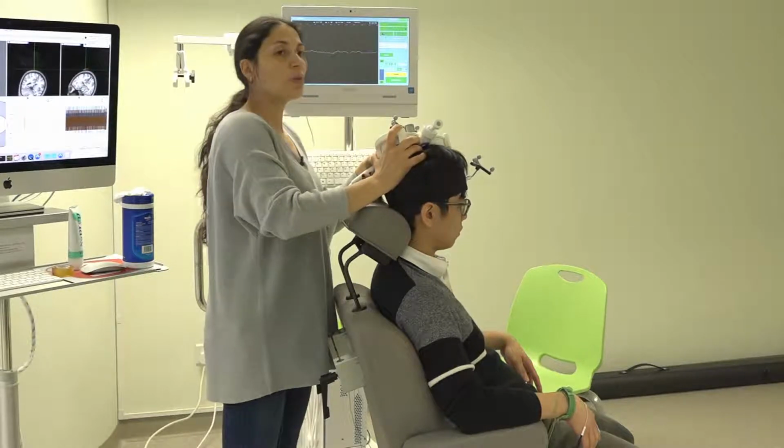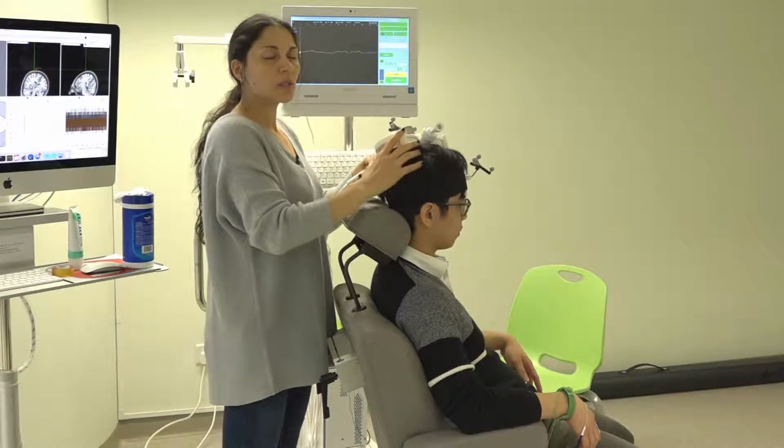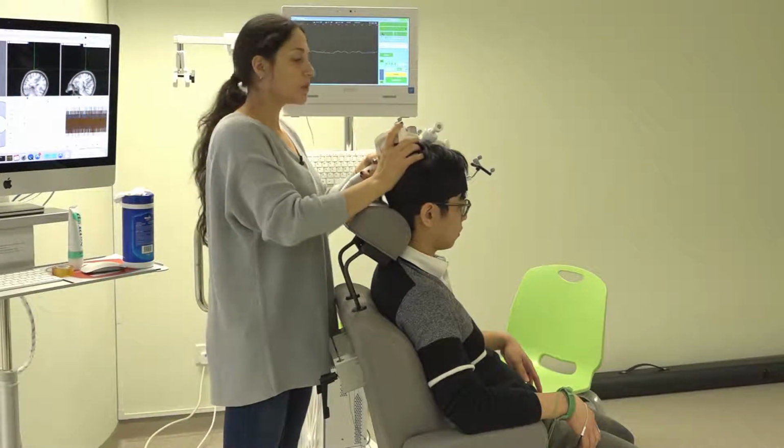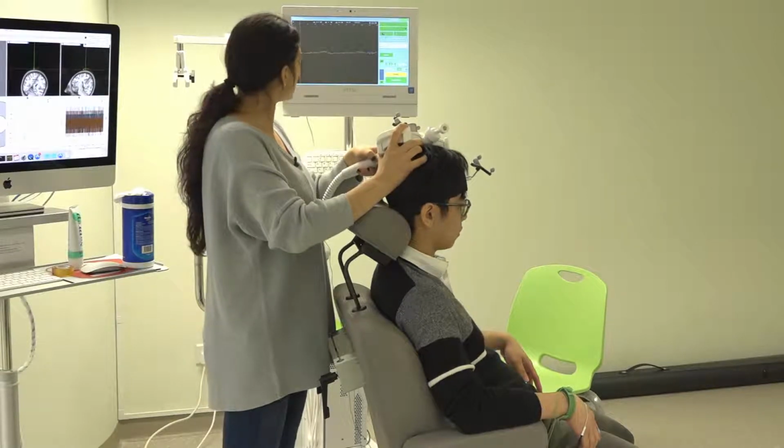He should keep the eyes always open, looking at one point in front. No eyes closed. You don't want eyes closed. Eyes should be open. This is muscle activity.